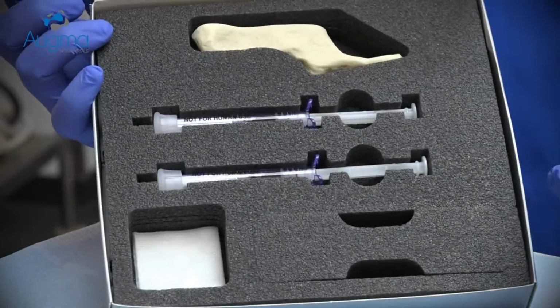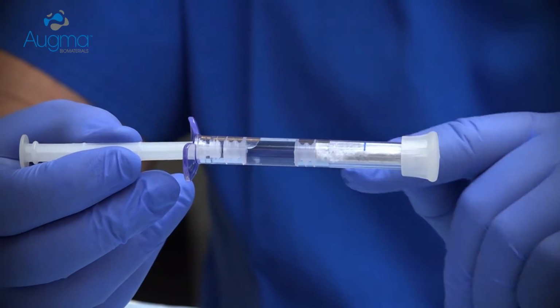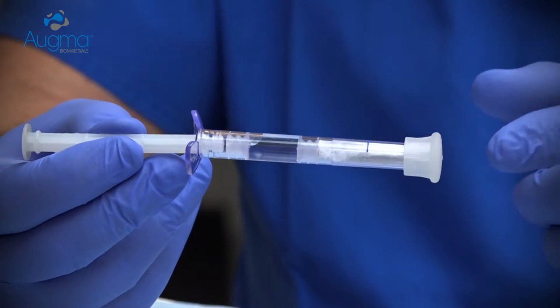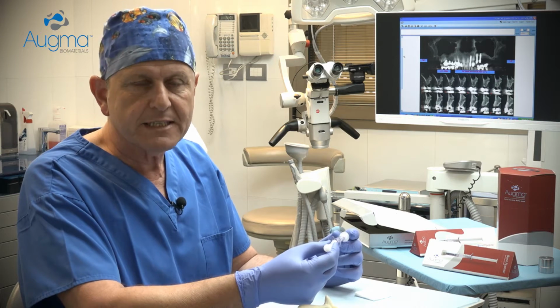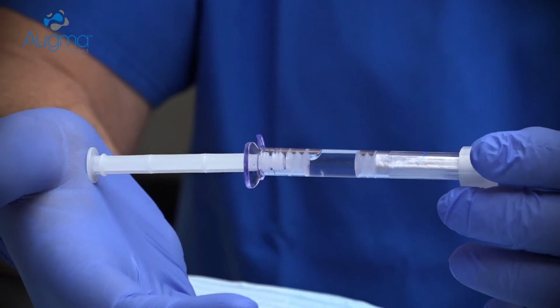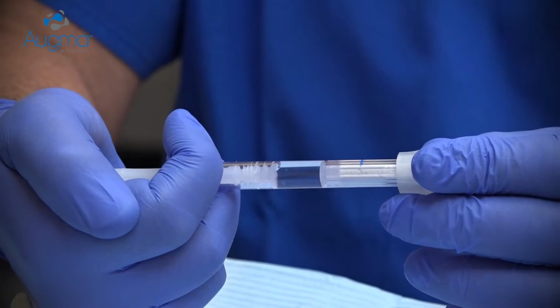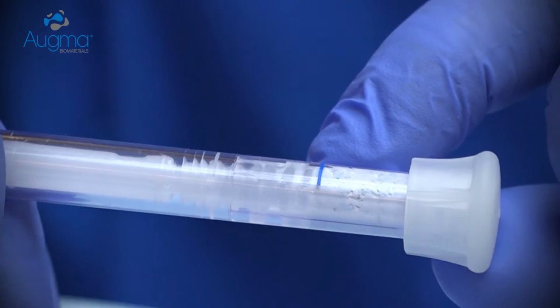This is the Bond Apatite syringe. It contains the powder, the liquid, a shaft, 2 pistons, blue indicating line, and the syringe cap. Now, in order to activate the material, all you need to do is push the shaft against the palm of your hand and start pushing the piston until the first one reaches the blue line.